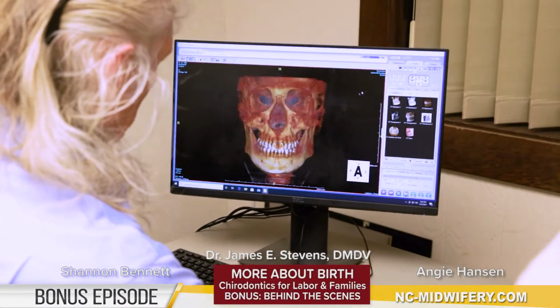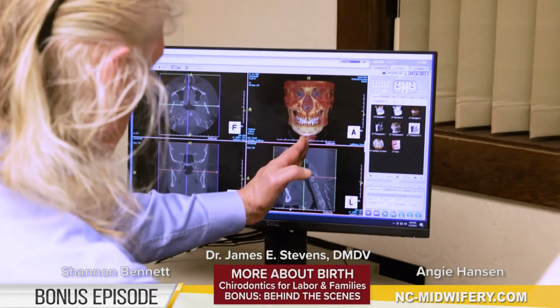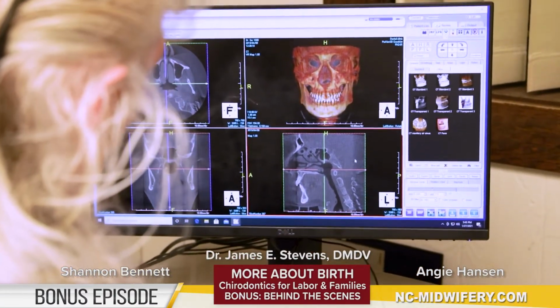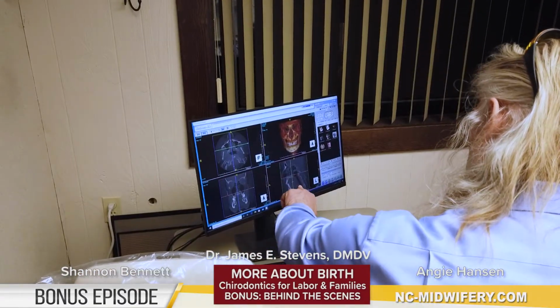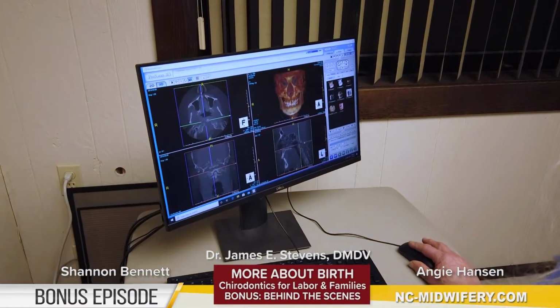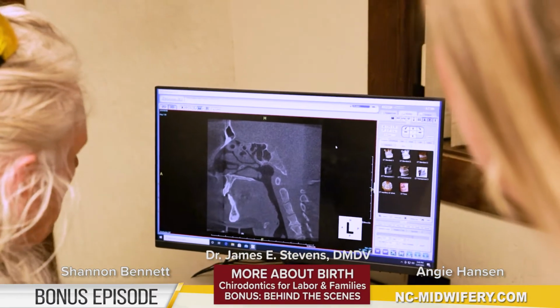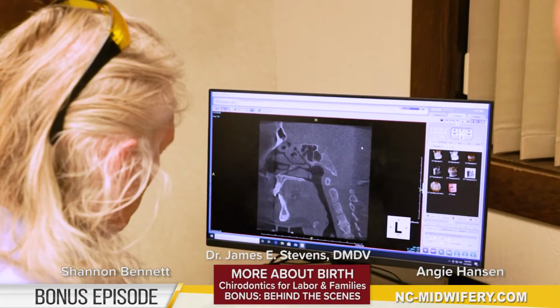That's awesome. The other thing that we do is take a slice right through here and lay it sideways. You can see the nose, eyes, teeth, and the airway. The airway is a big issue, so we want to line up on that airway, on the most narrow part, because that's going to be the restrictive part. We're not going to get any more air through there than the narrowest part of that airway, just like your garden hose. This is right behind the tongue. This is a male patient, and with children, etc., the concept is the same. The numbers are a little bit different.